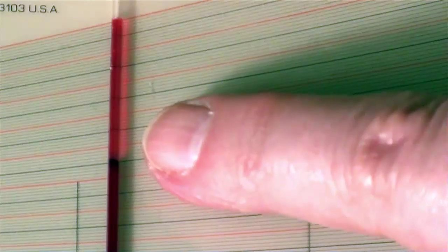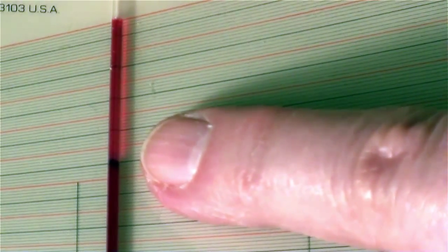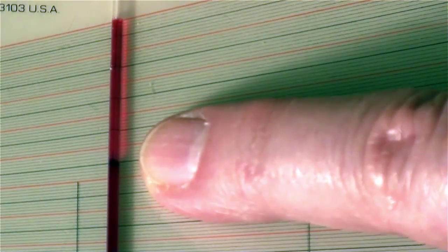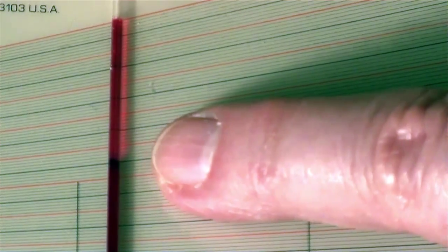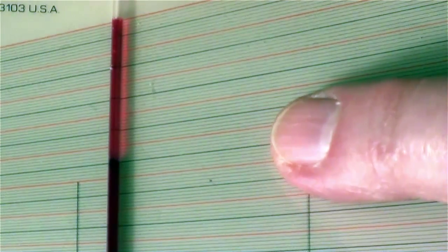Now we look right here at the top of the packed blood cells. That level of blood is laying against this dark blue line.